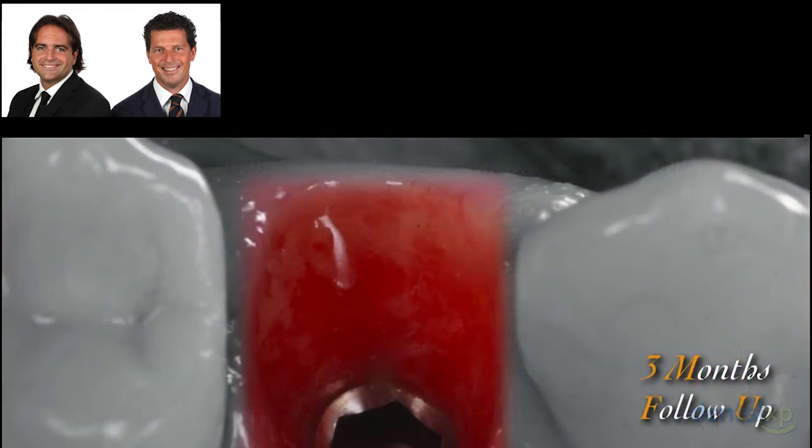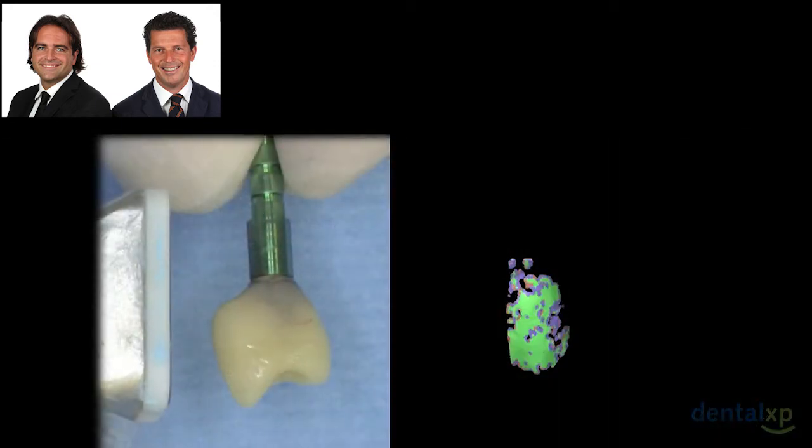And now we are back to the picture of the first case. You see, now you know a little bit more about the intraoral scanner, about the digital possibilities, and at the day of the digital impression, what are the advantages that these new technological tools are giving to us? We know that it took a lot of time for us to achieve a soft tissue like this, a thick, robust soft tissue like this, and we wanted to keep this. We know that when we unscrew the provisional restoration, immediately the tissue tends to shrink. But there is one thing that doesn't shrink, and this is acrylic.